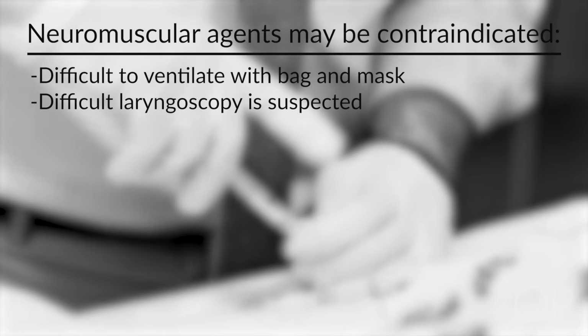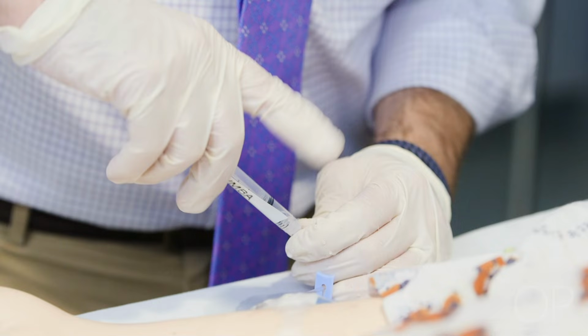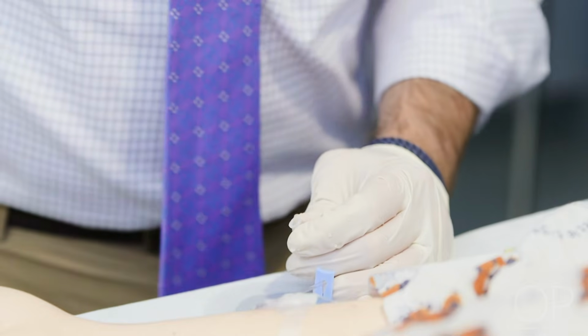Neuromuscular blocking agents may be contraindicated in patients who are not easy to ventilate with a bag and mask or in whom difficult laryngoscopy is suspected. Intubations without the use of neuromuscular blocking agents are more difficult and should preferentially be performed by a skilled intubator.